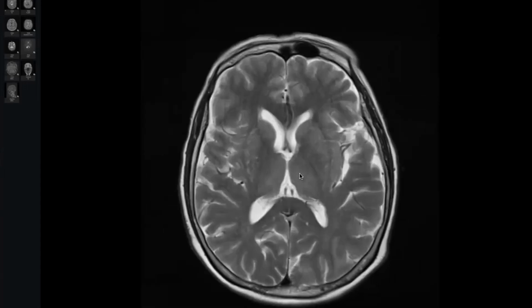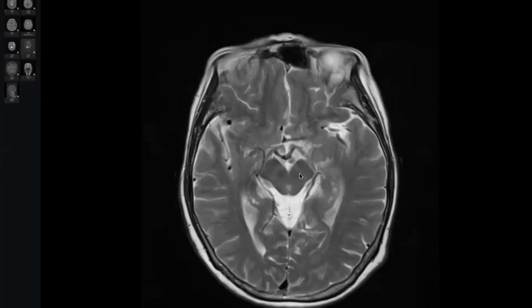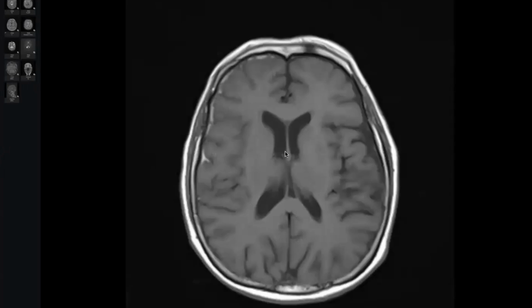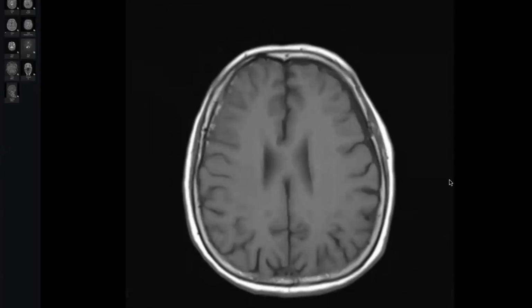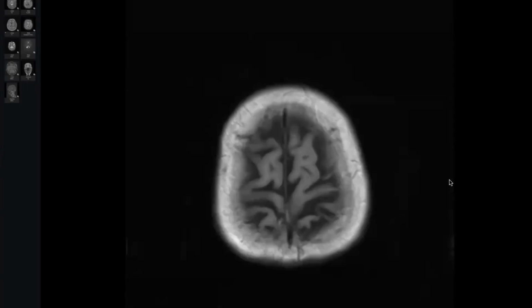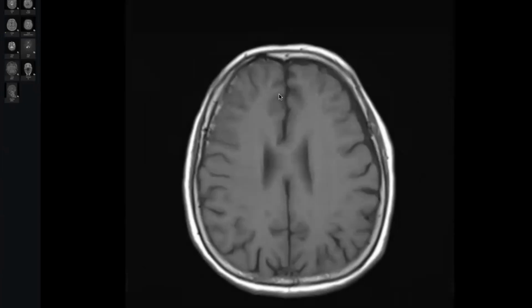I concentrated on the subarachnoid hemorrhage, I picked it up, and then I forgot to tell the examiner I would scroll to the top. I failed in this case. Why? Because of my technique.